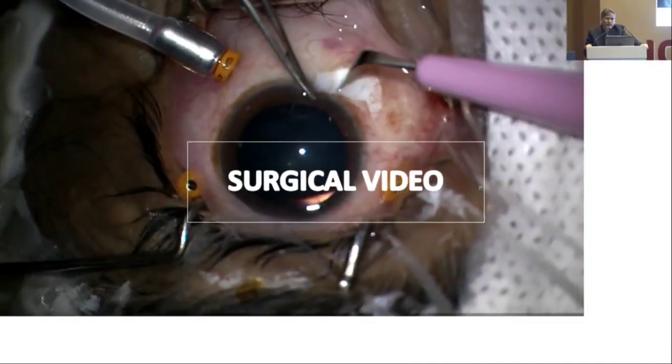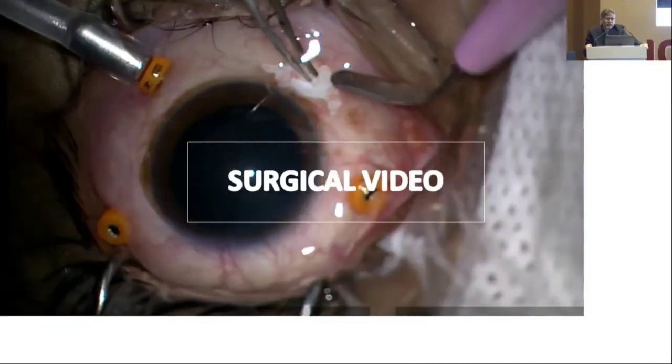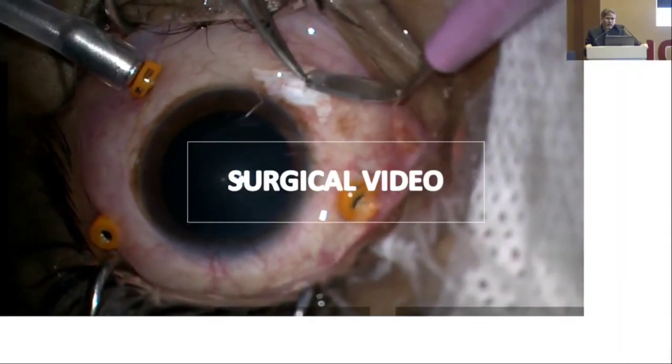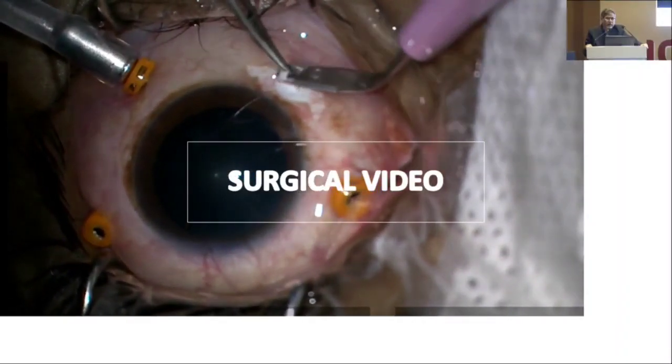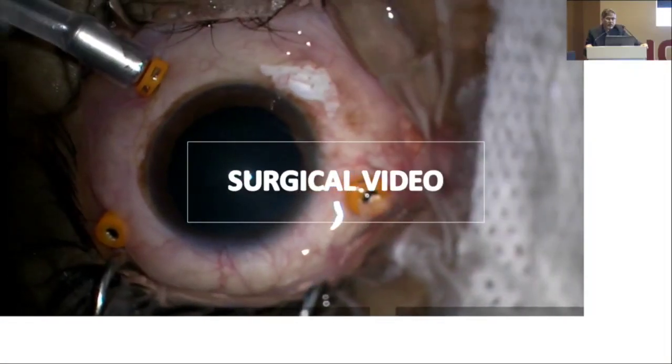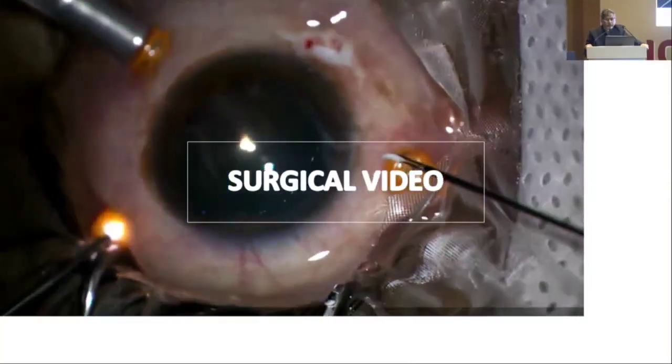From the sclera we are taking a part of scleral tissue. The important thing is we have to have a watertight closure of that pit. The pit communication is deeper, not at the top, so that can be assessed with swept source OCT. Now you can see with the VR, I am taking this flap over the disc.